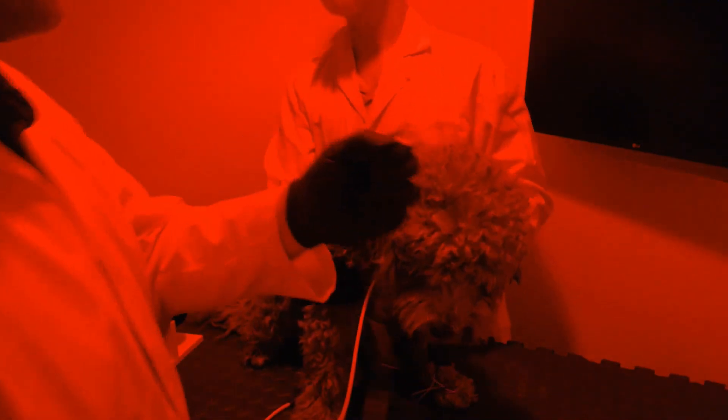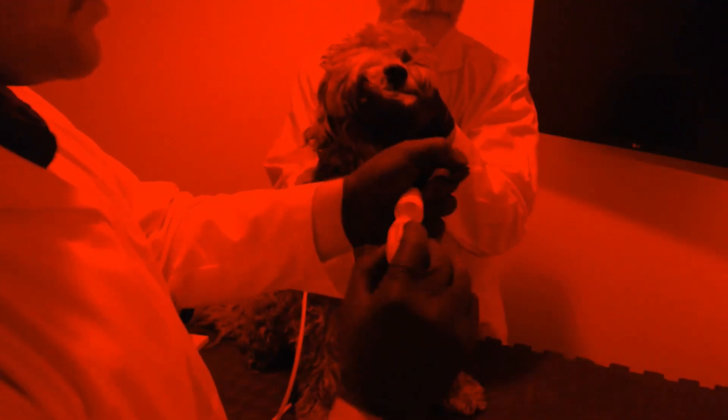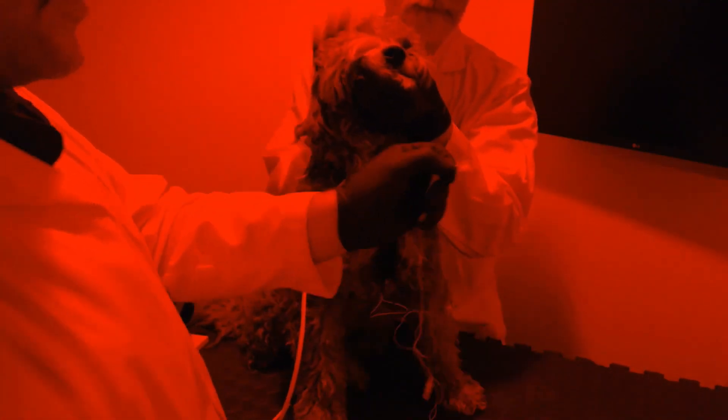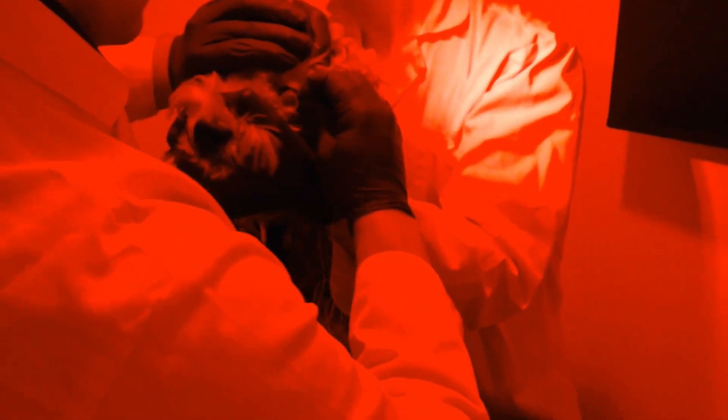The final electrode is going to be the RetMap K9 lens electrode. We will take the Goniovisc and fill the lens up about halfway — we don't want to go all the way, as we want it to make a sort of suction cup effect. If we fill it up all the way, it has a high likelihood of drooping and falling out. Get that placed right on the eye, take a piece of tape, tape it into place, and place the other side into the pod.